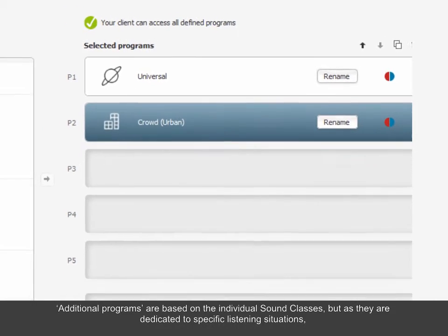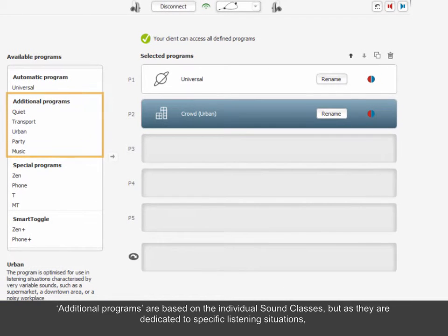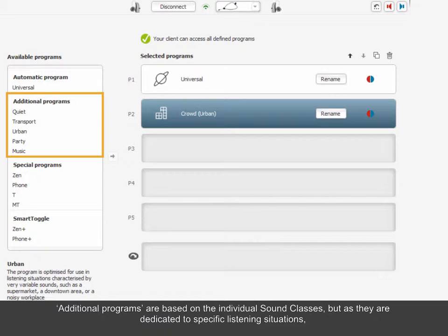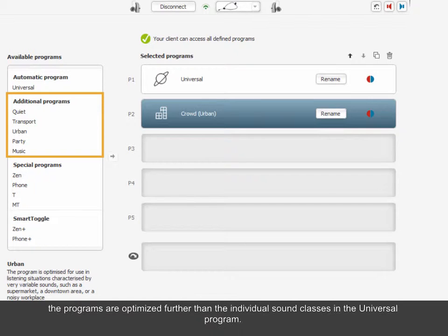Additional programs are based on the individual Sound Classes, but as they are dedicated to specific listening situations, the programs are optimized further than the individual Sound Classes in the Universal program.